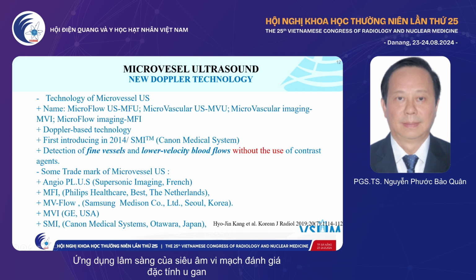So we move to new technology for detecting microvessels. There are many names for these techniques: microvascular imaging and microflow imaging. The technique was introduced in 2014 by Canon Medical Systems. It permits detection of fine vessels and lower velocity blood flow without the use of contrast agent.